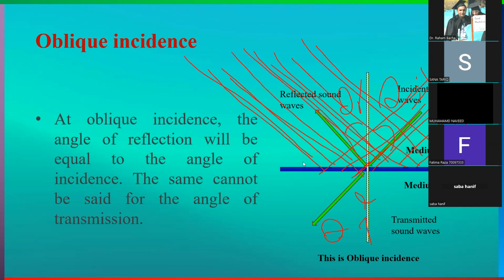No. Okay, so these sound waves are not coming back towards the transducer. You see that the reflected sound waves are going in another direction, somewhere else. They are not coming back towards the transducer. So irrespective of the strength of this reflector, this structure will end up not being seen here because the sound waves are not coming back. This phenomenon is called anisotropy, and you will face it most commonly in musculoskeletal ultrasound, right?